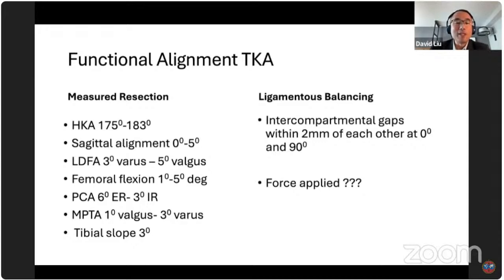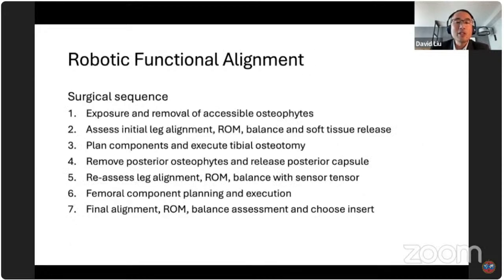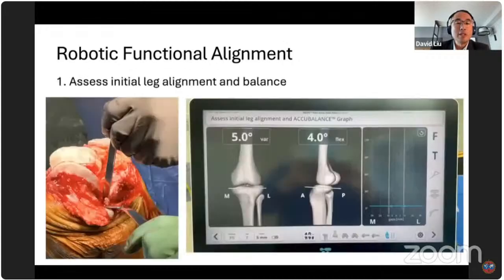I think one of the big things that we still have to decipher is how much force we apply when we are stressing the ligaments. So this is my surgical technique, which I'll run through. And it is a tibia first technique, and I'll explain why I do that first.